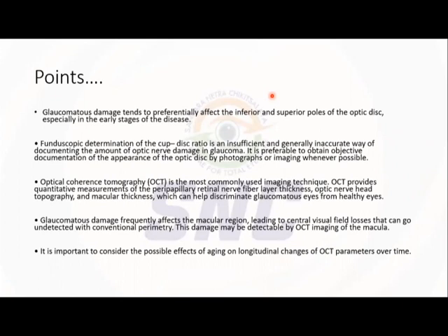You didn't keep an OCT report properly. So there are zones. How you see them in the visual field report, there are zones which have to be looked for in the OCT, not directly going to the color coding of the sectoral map. You have mentioned 4 clock hours, superior, inferior, nasal.